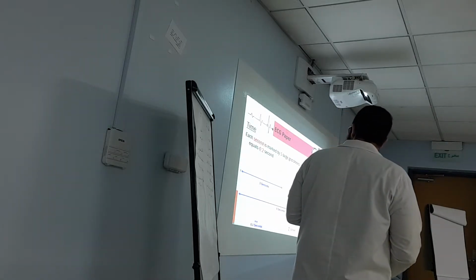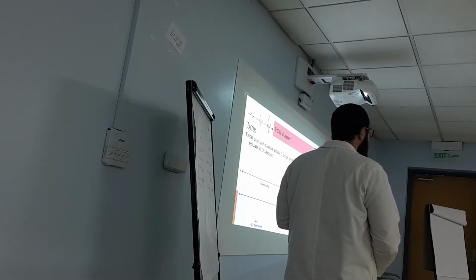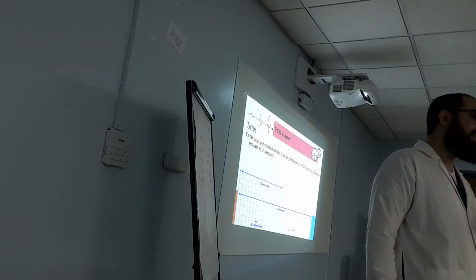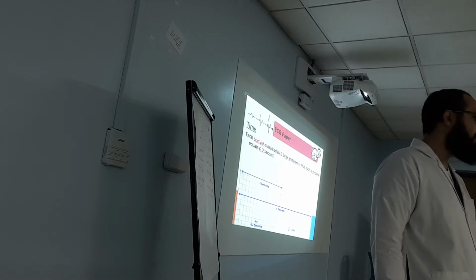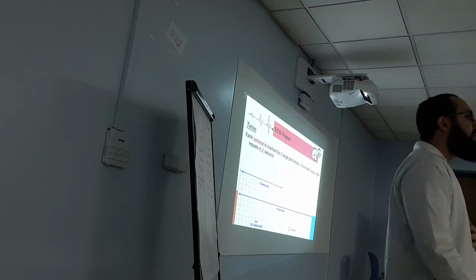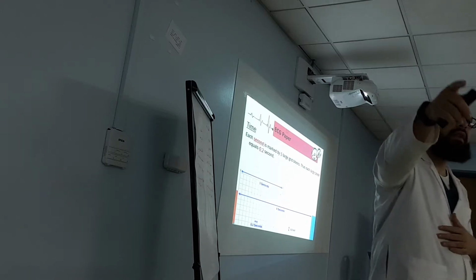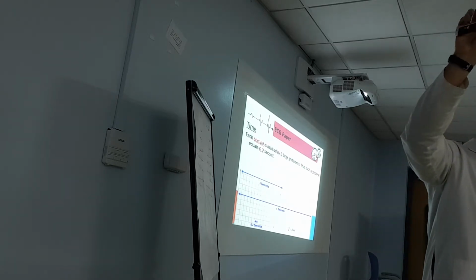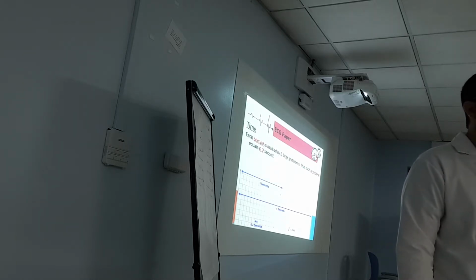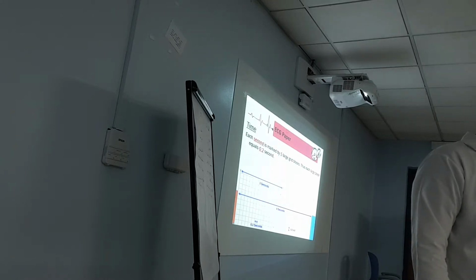Usually the paper is marked every 3 seconds, or every 15 large squares. Because how many large squares in 3 seconds? It's 5 per second, so 3 seconds, 15. Okay, how many large squares in 6 seconds? Now I have 1 second, 5 large squares. So in 6 seconds, 30. Okay.